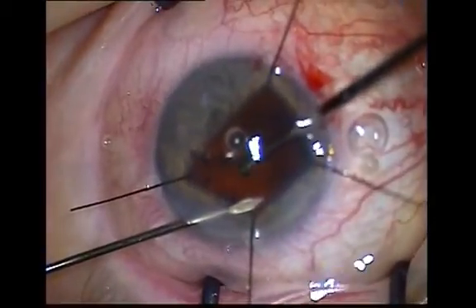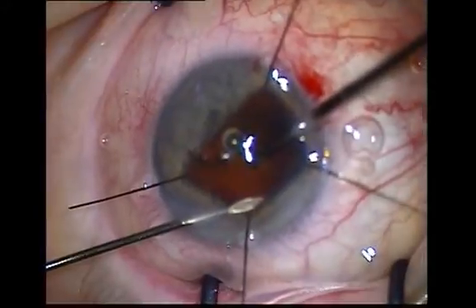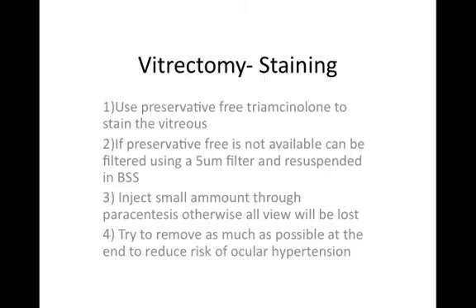In this video, cortex is being removed in addition to the simple cutting of vitreous. It is an advanced technique and involves the intermittent use of I/A when vitreous is cleared. Its main aim is to ensure a quiet eye by removal of as much cortex as possible. At the finish, one can use a dry swab very gently to assess whether there is vitreous present at the section or not, by looking for deformation of the pupil.